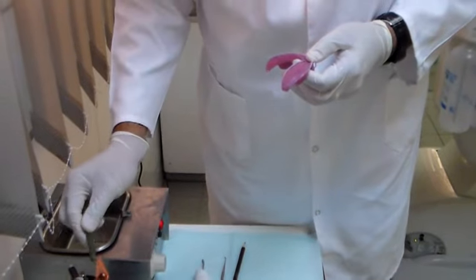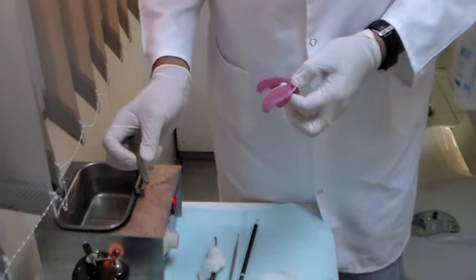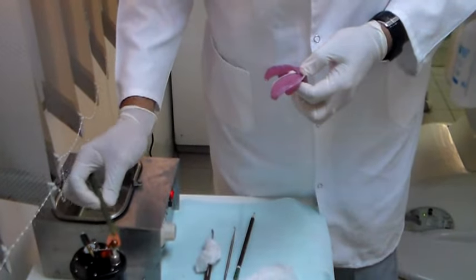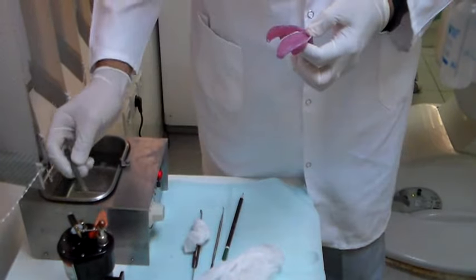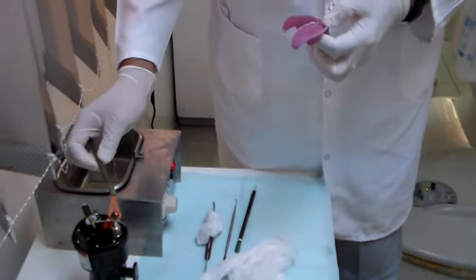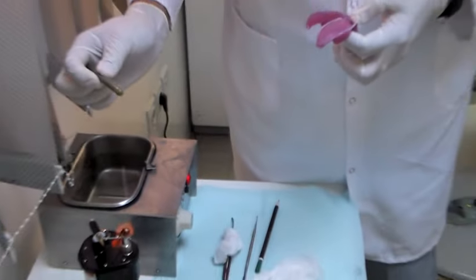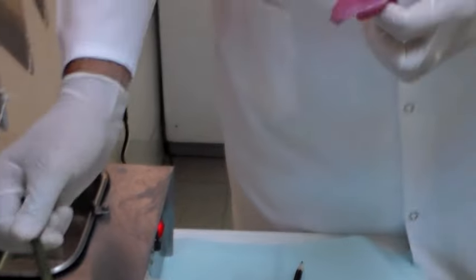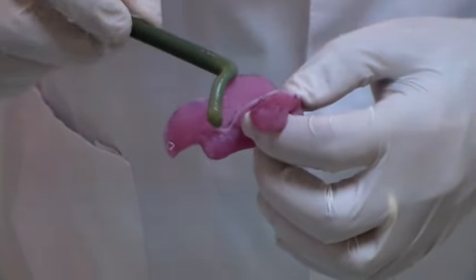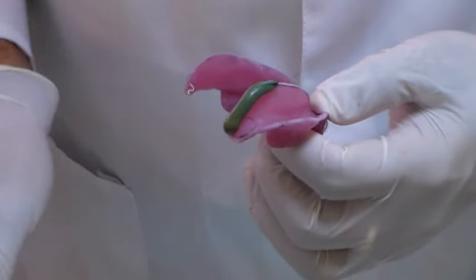So we're going to start molding our mandibular special tray. I'm going to start with my retromylohyoid region. I'm going to soften a little bit of my compound — you always want to soften just a very little bit, because otherwise you cannot manipulate the material. I want to soften it over a direct flame; my water bath is set to 60 degrees Celsius. Soften it over direct flame — you can see it's shiny and slumping slowly. At this point I'm going to place the material over a dry tray.